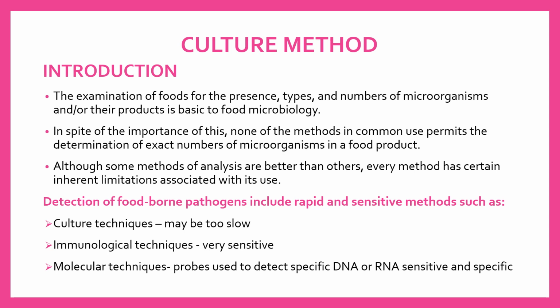Now we'll see detection of foodborne pathogens, which includes rapid and sensitive methods like culture techniques, which may be a very slow one, and immunological techniques, which are a very sensitive method, and molecular techniques, which use probes to detect specific DNA or RNA, sensitive and specific.